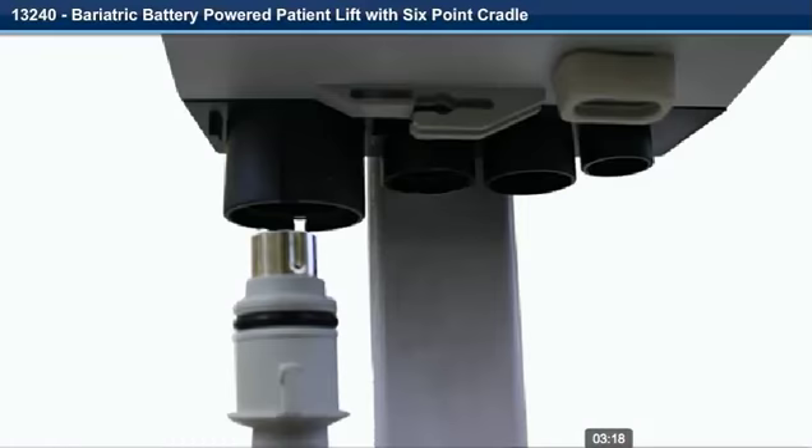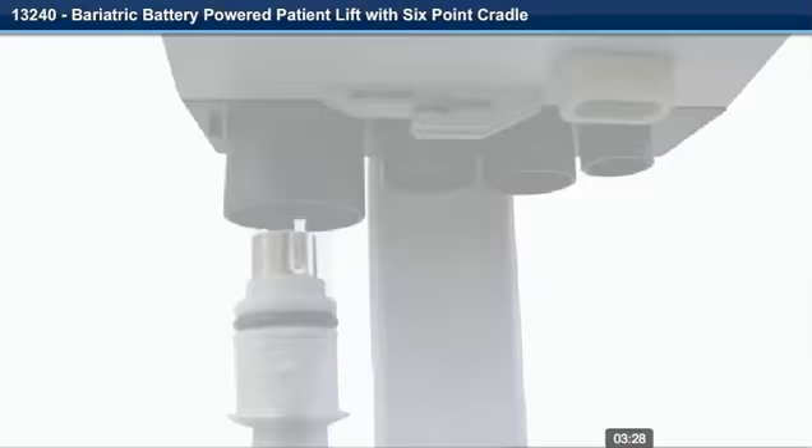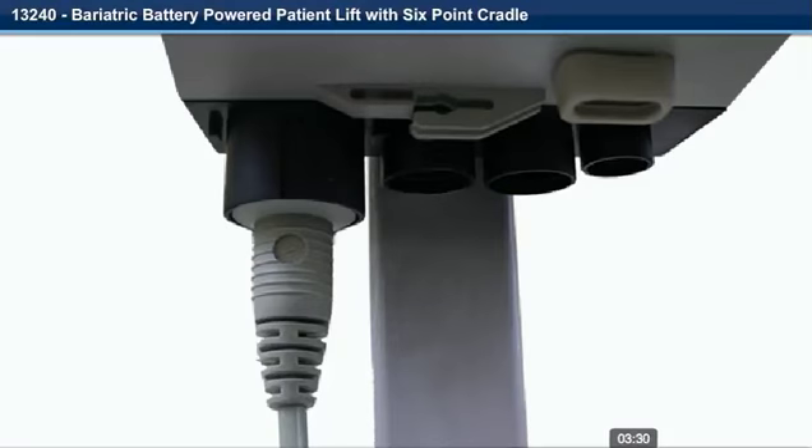Step 21. Align the tab on the plug of the hand control with the indent in the hand control socket. Step 22. The plug must be pushed in flush with the controller. If there is any difficulty when inserting the plug, a very small amount of petroleum jelly on the rubber O-ring is required.